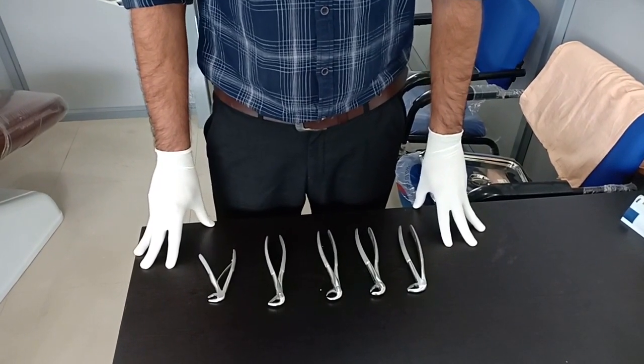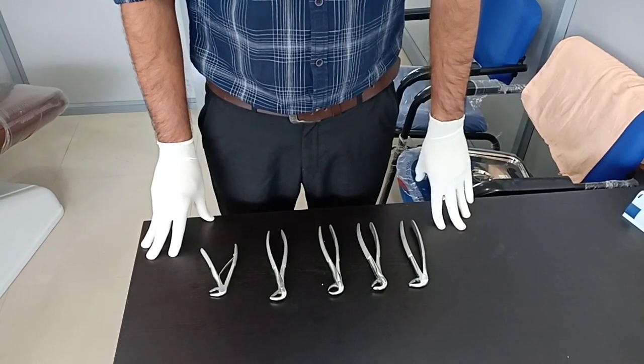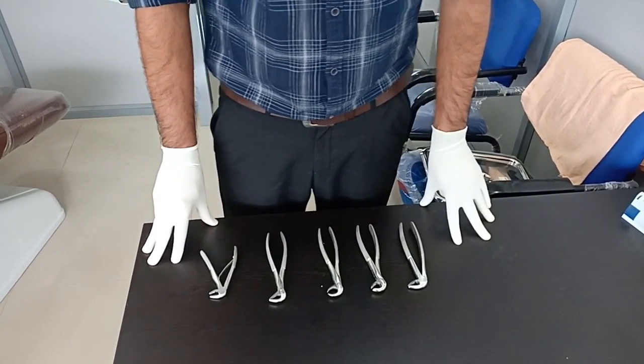Welcome back to Dentistry and More. Today's session we will be covering the mandibular tooth extraction forceps. The last session we had covered maxillary forceps.